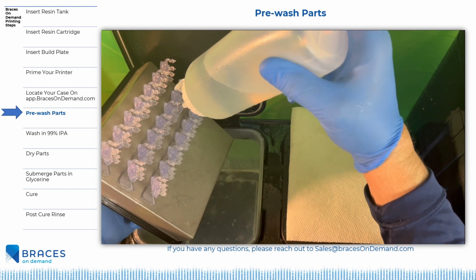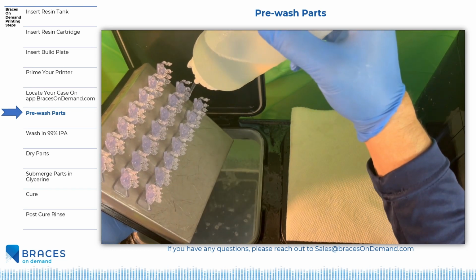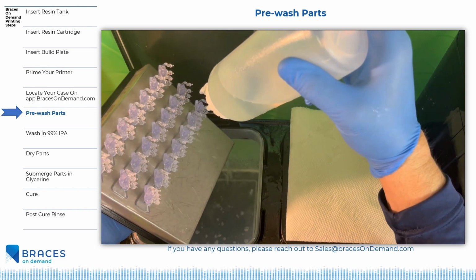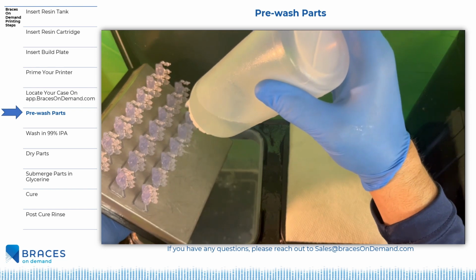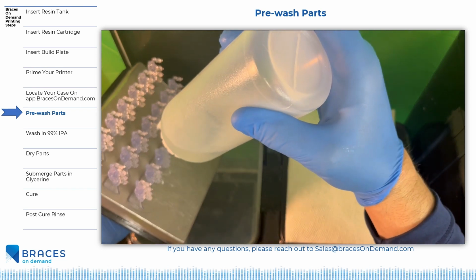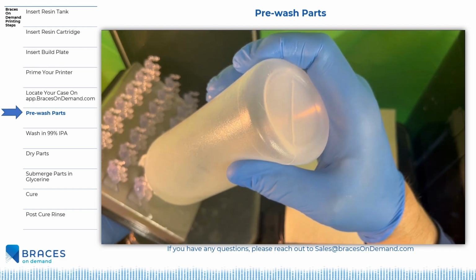Do I have to use 99% IPA in my Form Wash? Yes, this is an often overlooked requirement that results in less than perfect parts. Remember, it is very important that bracket slots are precise. Using 99% IPA ensures that no resin residue will remain after wash.